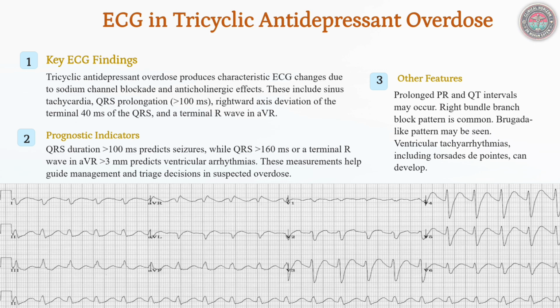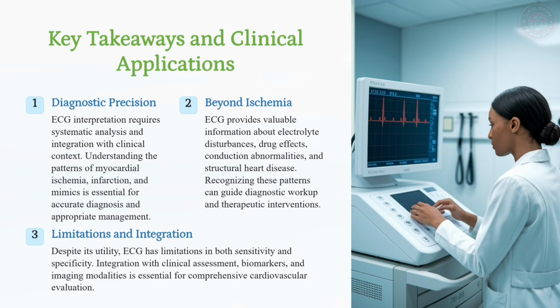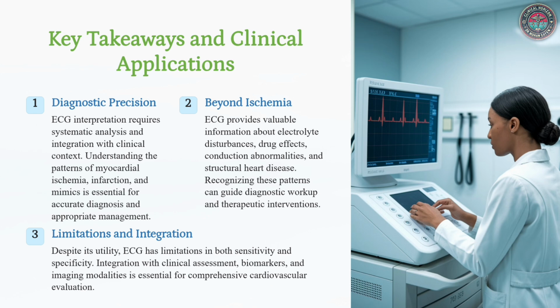ECG interpretation is a cornerstone of cardiac diagnostics, allowing clinicians to detect ischemia, infarction, arrhythmias, and systemic disturbances. Mastering these principles ensures prompt recognition and appropriate intervention, ultimately improving patient outcomes. A systematic approach to ECG analysis, integrating clinical context, is essential for accuracy and effective decision-making.